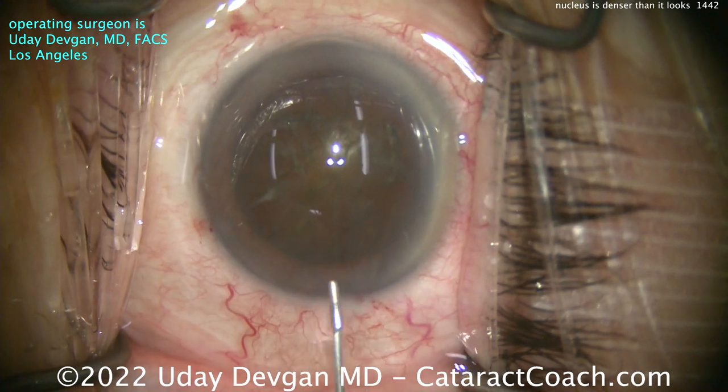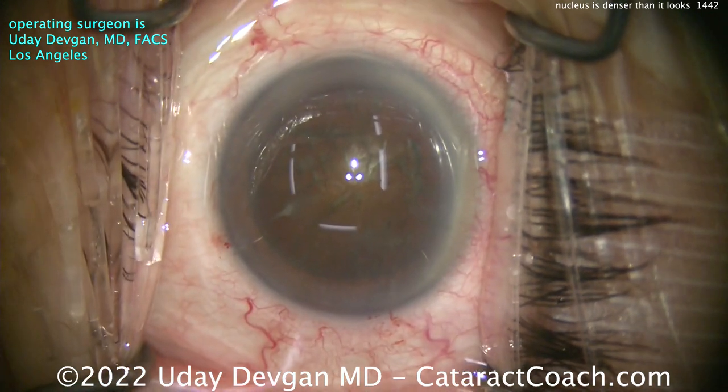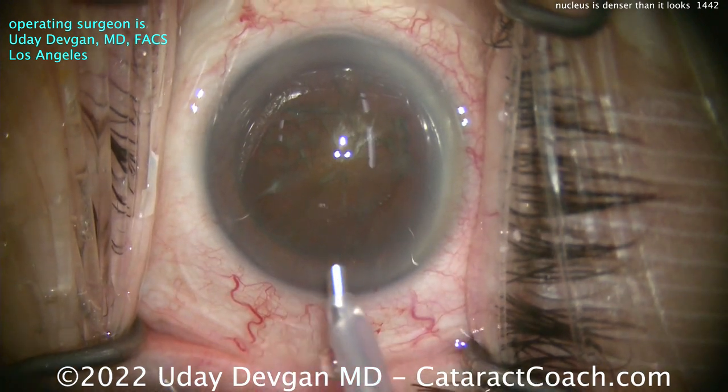Rotating that nucleus. Now you can see we've lost the red reflex a little bit, putting a little more viscoelastic — a small aliquot — to protect that central corneal endothelium. Here comes our phaco probe. We're going to go in bevel down and do a chop technique here.